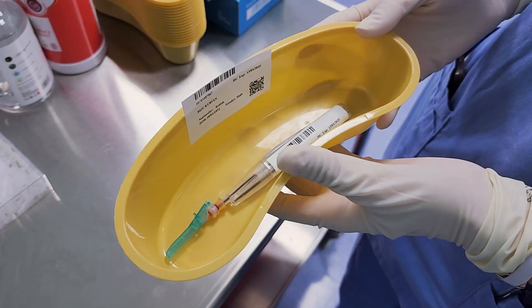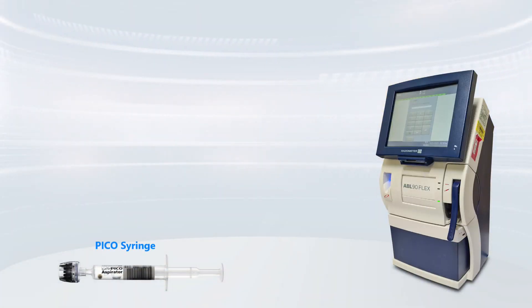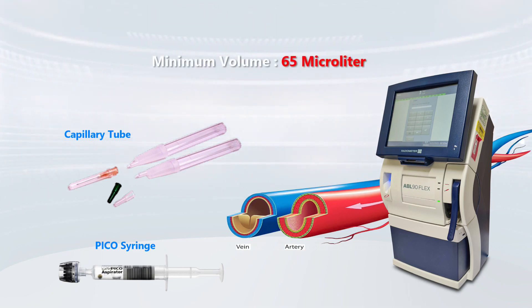To prevent incorrect results, it's mandatory to use a recommended sampler — pico-syringe or a capillary tube. The ABL 90 Flex is designed for use with arterial, venous, or capillary whole blood and requires a minimum volume of 65 µL.